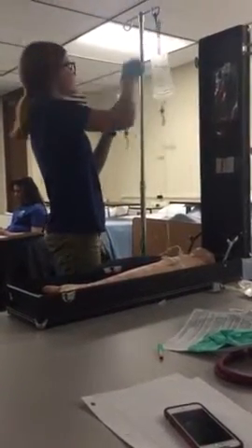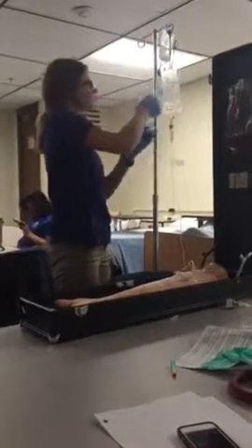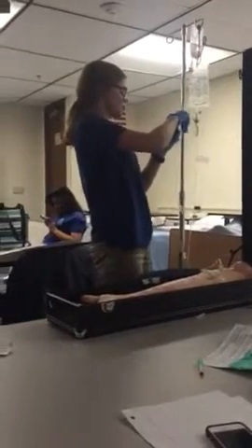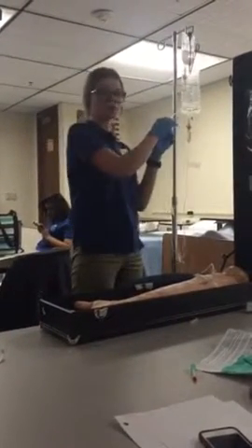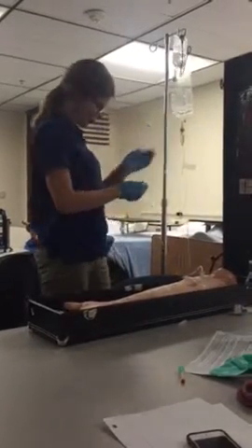Find a bouncy, resilient vein that is not on the dominant side, not on the side you have a shunt for renal dialysis. Label your tubing, and on your tubing you label the date, the time, and your initials. I'm going to go right here.